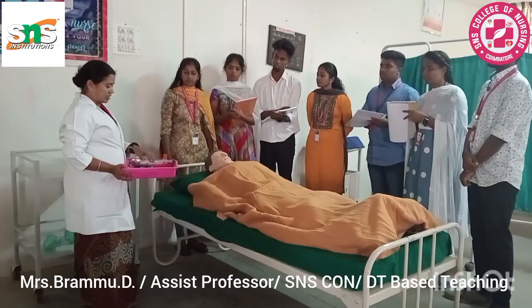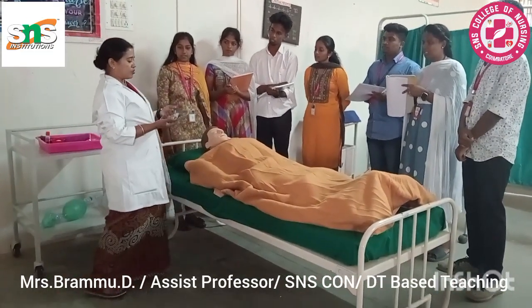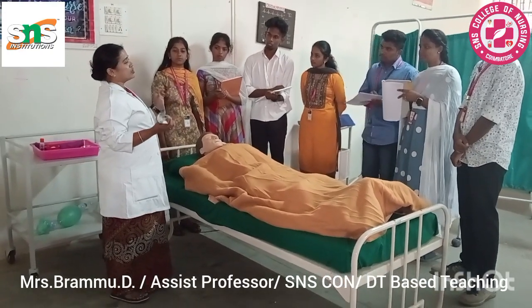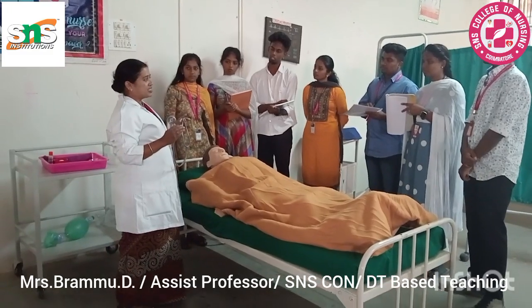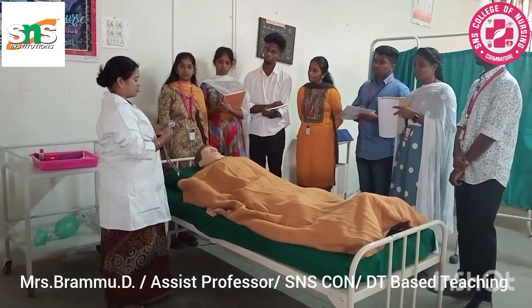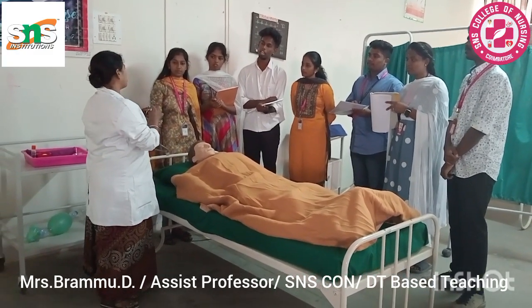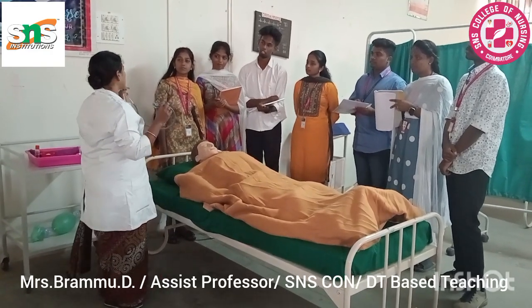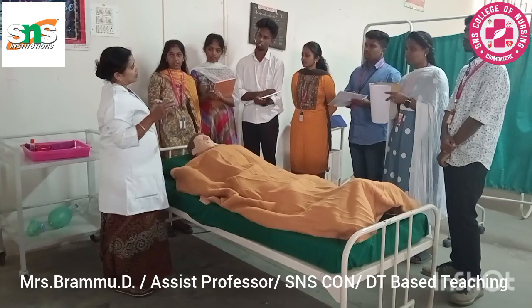We also have a main instrument which we are going to use, the stethoscope. The stethoscope is mainly used for auscultating high pitched and low pitched sounds. To assess the high pitched sounds, we can use the diaphragm, and to assess the low pitched sounds, we can use the bell of the stethoscope. This instrument can be used for auscultating not only heart sounds but also lung sounds and bowel sounds.